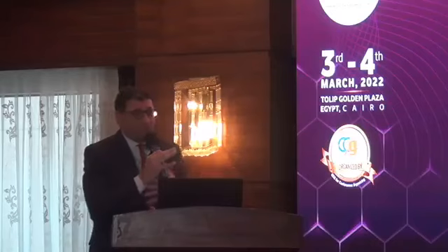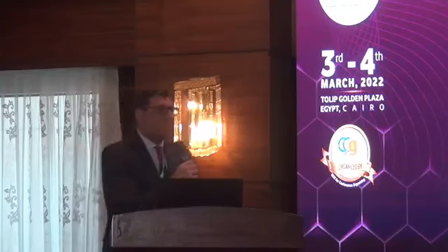But if he has well-developed skull bones in the CT with bone window, we can perform surgery. We ourselves did 7 years old, but there are reports in the literature as young as 3 years old.